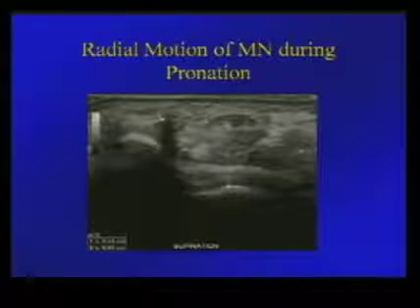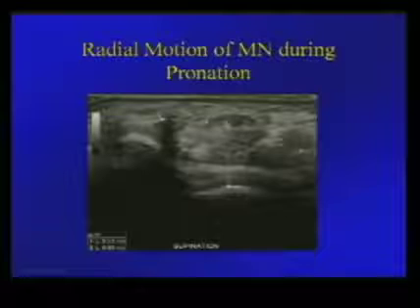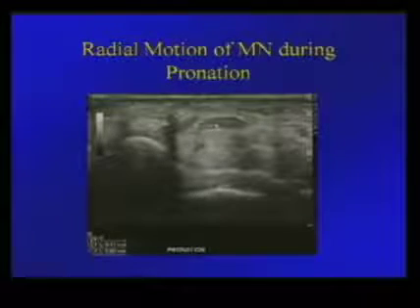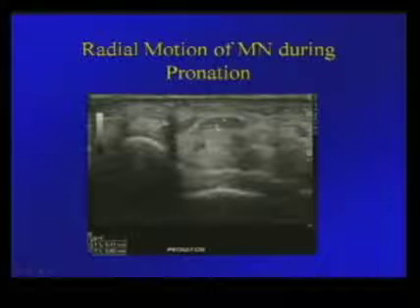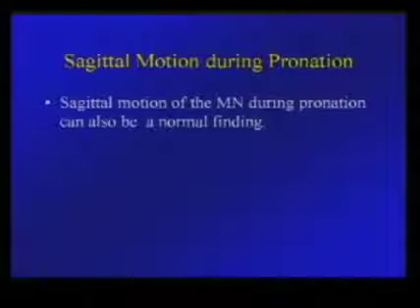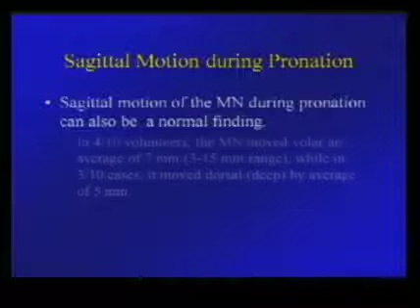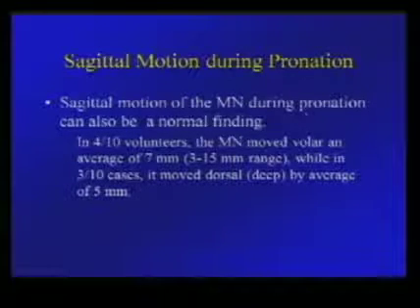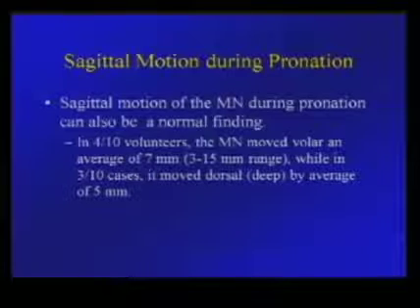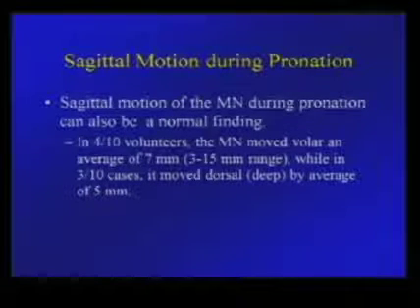Showing here in supination: the location of the median nerve relative to the capitate bone and the flexor carpi radialis. However, when you pronate the hand, the nerve in this patient moves towards the radial aspect of the wrist — a significant movement during pronation. There is also sagittal motion of the median nerve during pronation, and it can be a normal finding. In four out of ten volunteers, the median nerve moved toward the volar aspect, while in about three volunteers it moved toward the dorsal aspect — no real predilection, but it does move often during pronation.